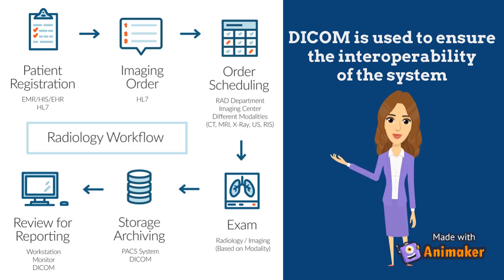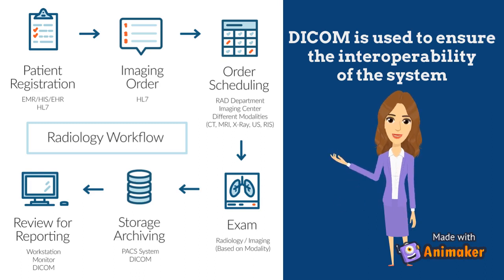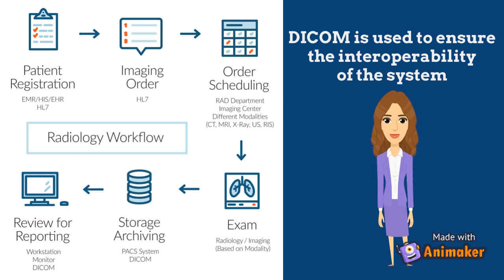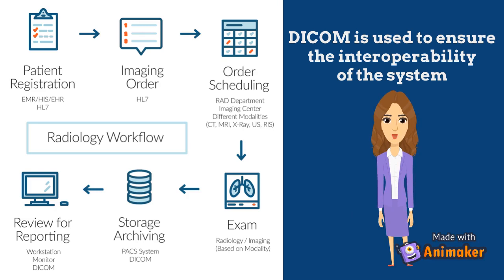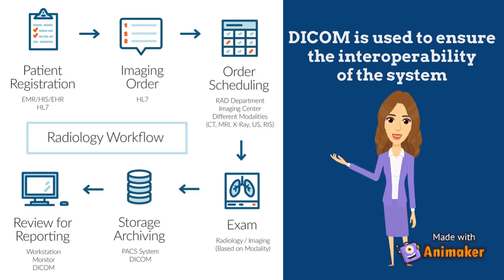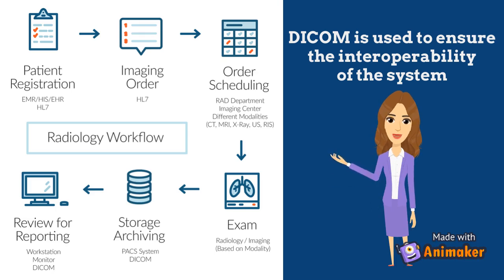The first one is to transmit and process images and related data between endpoints. Second is to query and retrieve files. Third is to perform specific actions like printing or archiving. Fourth, to support digital imaging workflows. And the last one is to provide high-quality images for diagnostics.